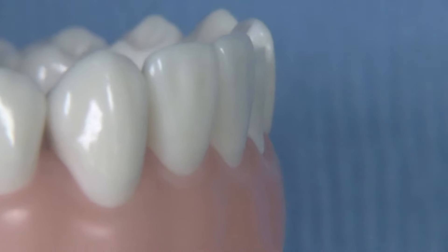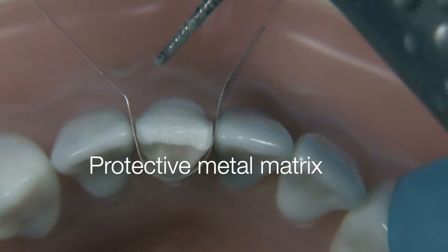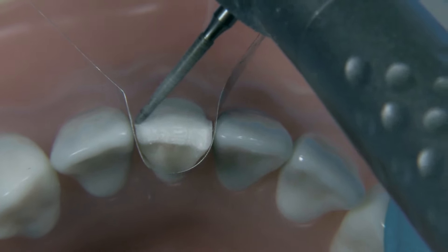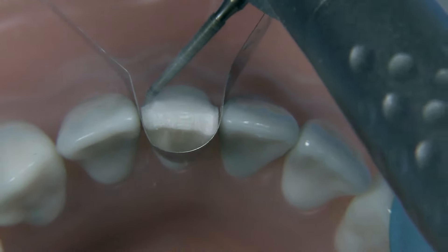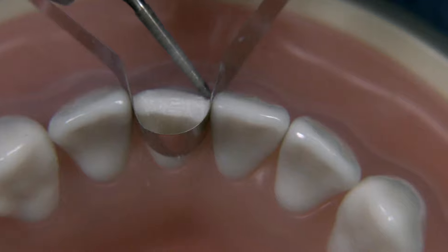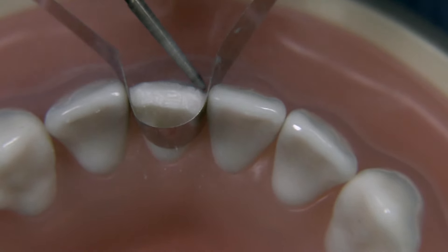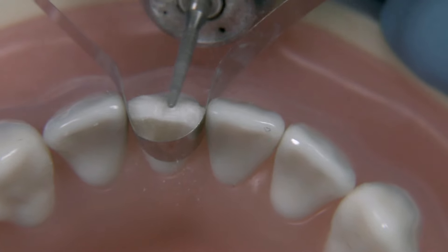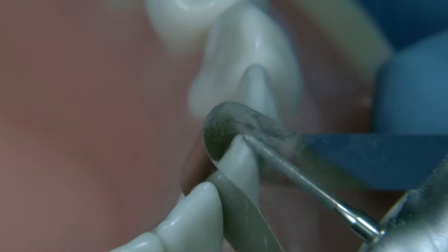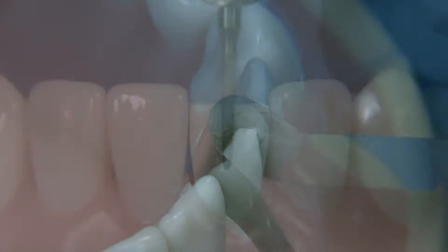Going back to the putty to make sure that you have everything properly reduced — this is a nice exercise to go through. I think we're pretty close here. Now I'm going to put a protective matrix in again, but this time I'm going to have it wrap around both sides. I'll show you how we would blend the facial to the incisal — you don't want a sharp delineation between the facial and the incisal; this should really wrap over so that you reduce stress on the ceramic material. Remember: do not bevel the lingual — leave it as a butt joint.